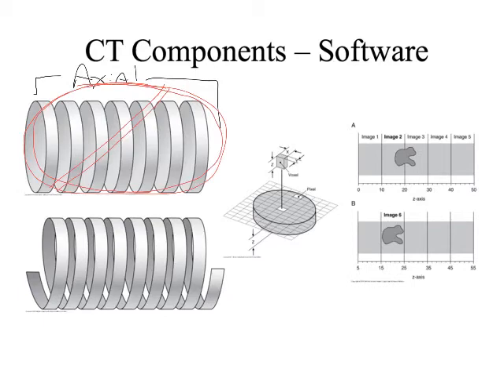But largely, what we've got in an axial data set is this scanner. So here's our z-axis running through this axial data set. Sometimes this is called step and shoot scanning. So move the table, scan the patient. Move the table, scan the patient. Move the table, scan the patient, right? And what that results in is each one of these little slices being a discrete data set, completely unrelated to the data set before it or the data set before that.